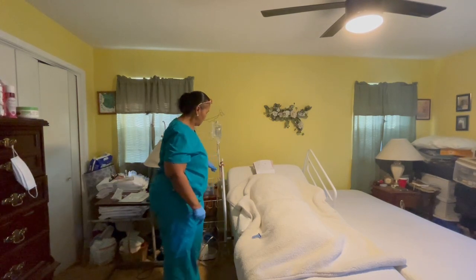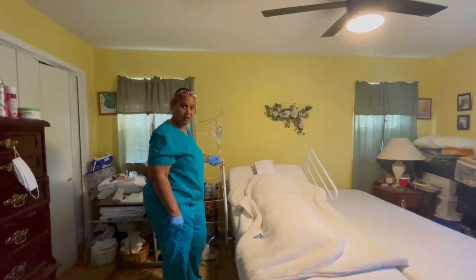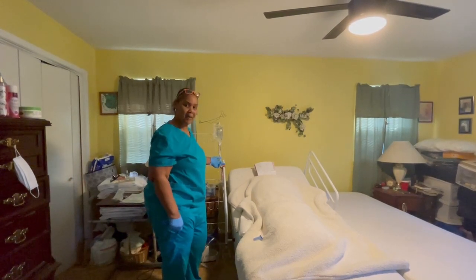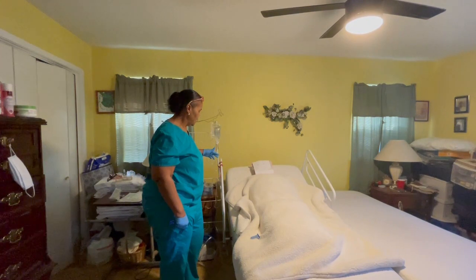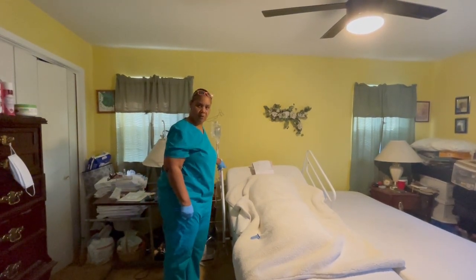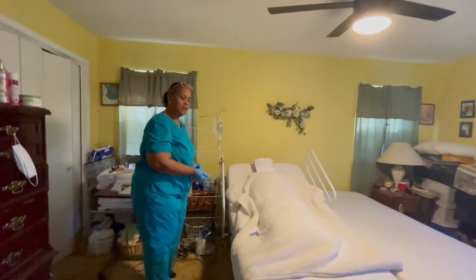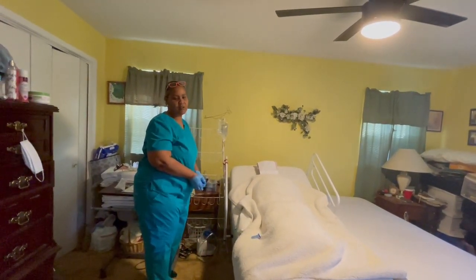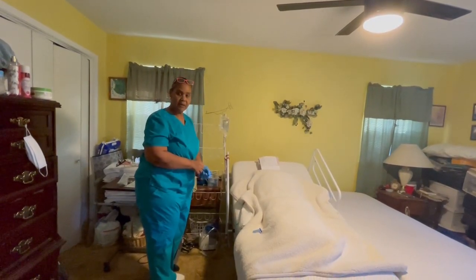You can check your pump, make sure your pump is off. You're going to take it back to primary. Once you take it back to primary, you want to make sure that you check the volume and the rate again, and then you'll turn your pump back on. Just make sure everything is running right, make sure everything is okay. Then you can return and start your documentation showing that you have documented your IV antibiotic in a timely manner.